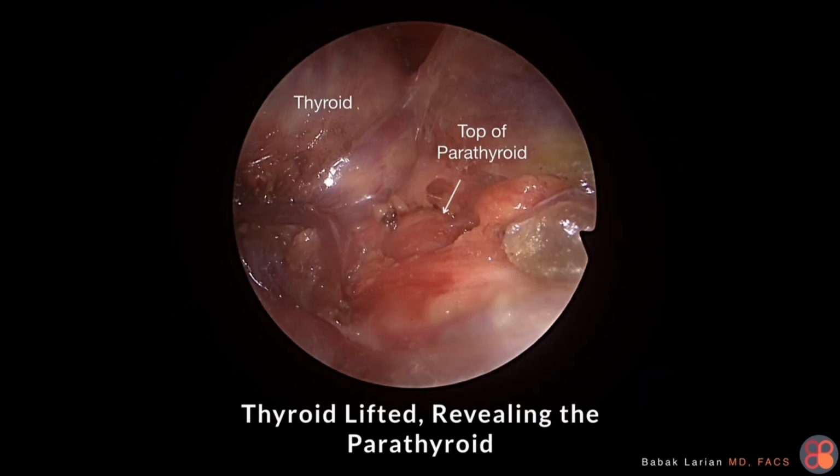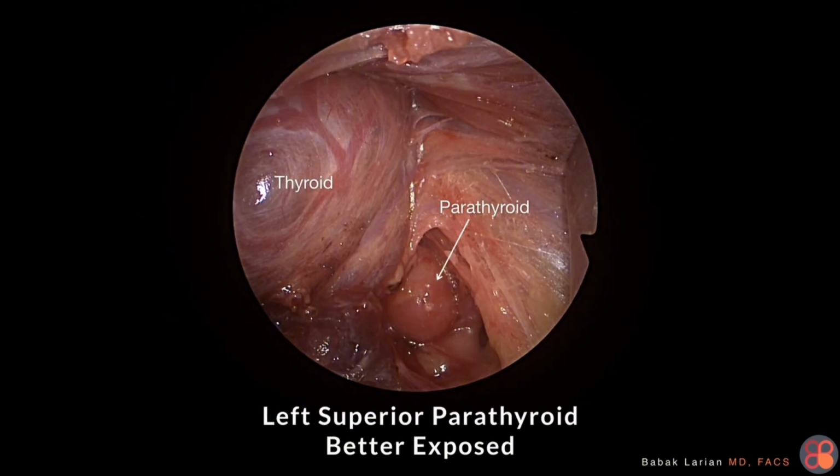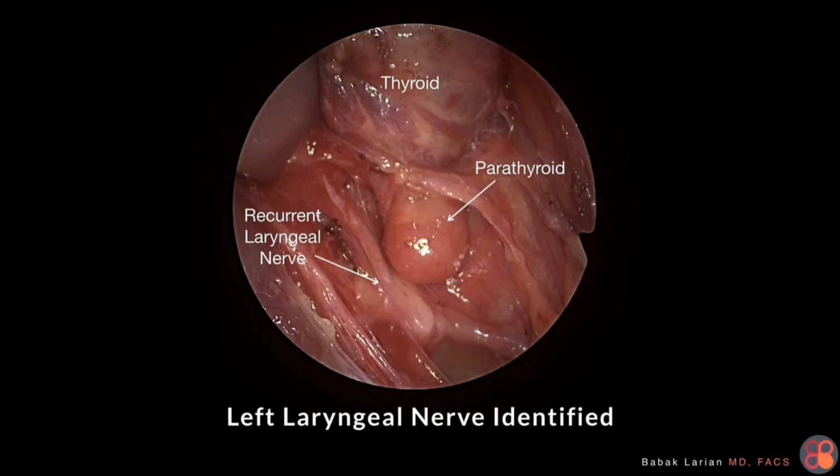And deep to the thyroid, again, thyroid here, we see the tip of the parathyroid right there, top of it. And then as we dissect gently and go deeper, we see more of that parathyroid gland. Again, the thyroid is visually obvious, and you can see the blood vessels on the thyroid itself. And you can keep everything clear. You can see the field is very dry. And now the parathyroid is dissected more. And now we can see the vocal cord nerve.